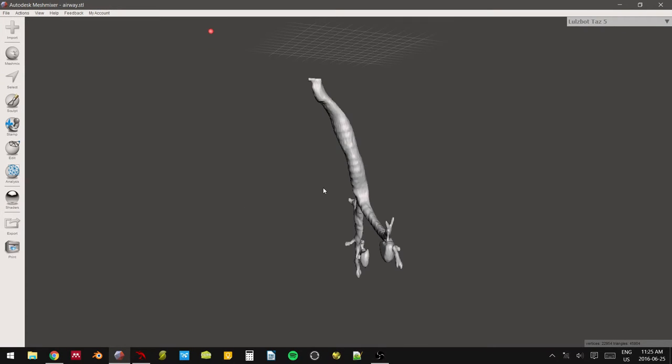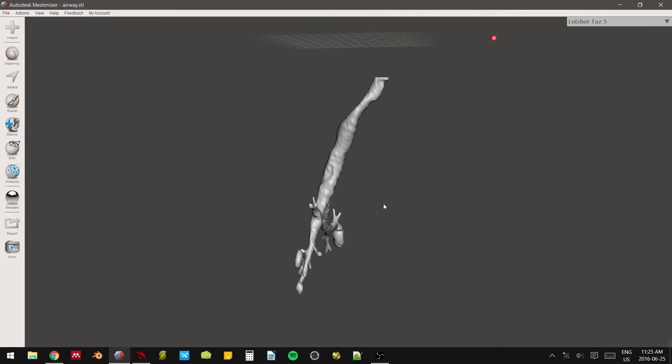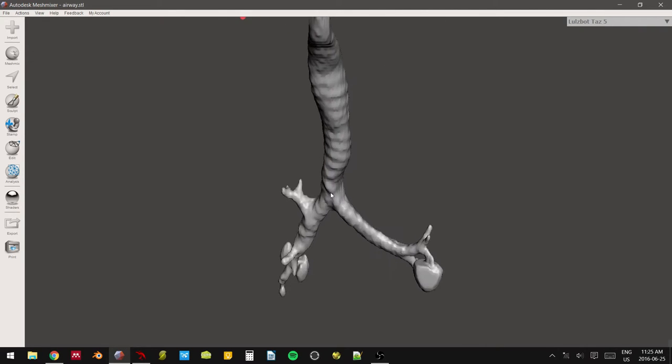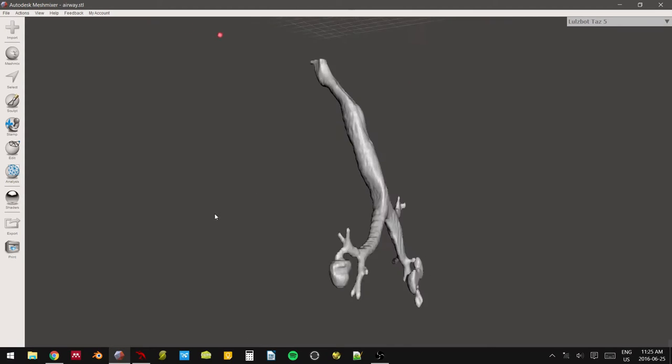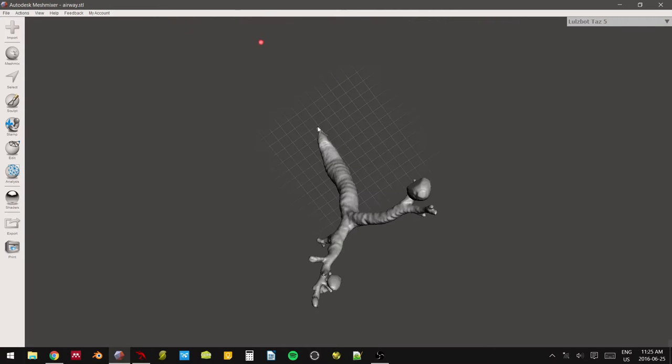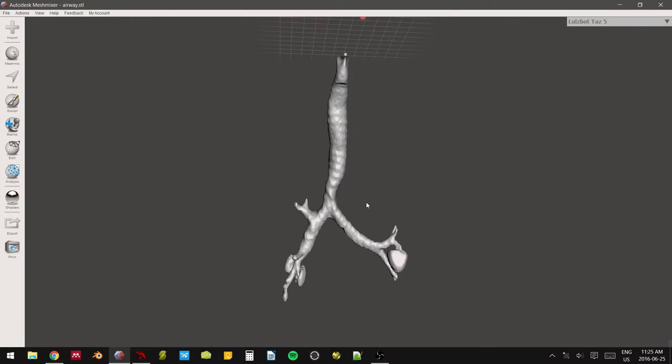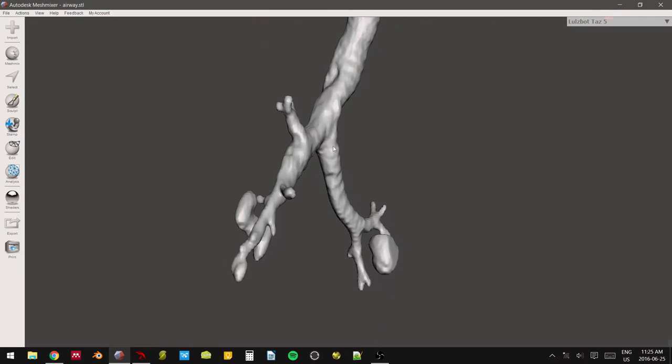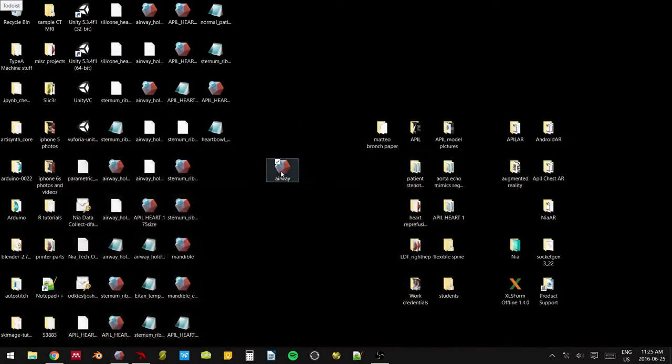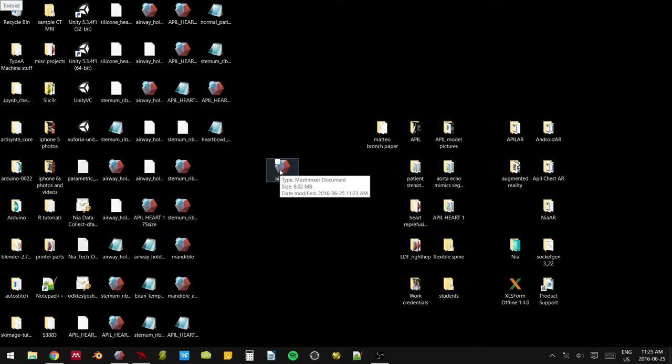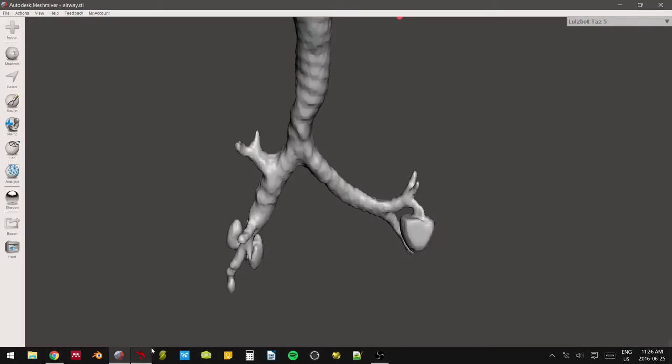There it is. It looks pretty good. So as you can see here in the lower right-hand corner, we have a 45,000 triangle budget 3D model, which is fairly lightweight. I don't think I'm going to reduce this any further than it is. It's pretty easy to work with. It's not taxing my system in any way. And it's still resulting in a fairly small file. In fact, the airway in its entirety as it stands is only 8 megabytes, and that's not bad.